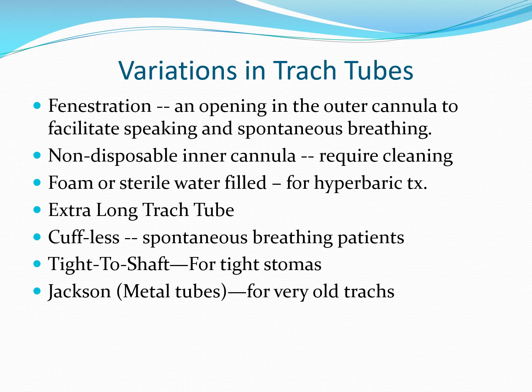Non-disposable inner cannulas, you can occasionally see them as well. In one of the ensuing slides later in this presentation, I will show you what an inner cannula cleaning kit looks like, the elements of it. They're pretty universal, to be honest with you. But those non-disposable inner cannulas do require regular cleaning in order to minimize any sort of plugging or infection risk. Foam or sterile water filled cuffs, you can also see them. So many of us have this assertion that if it's cuffed, that cuff is filled with air. It often is, but not 100% of the time.